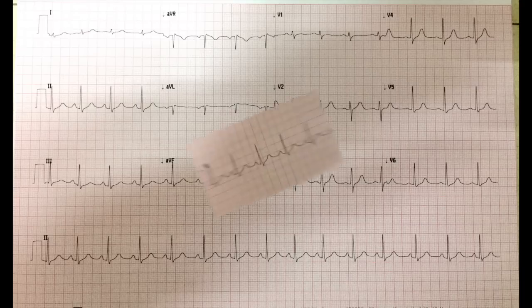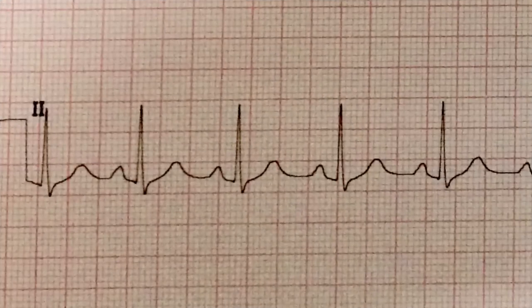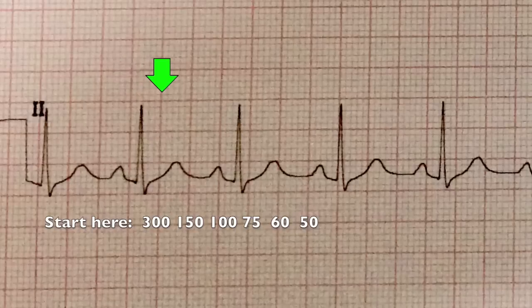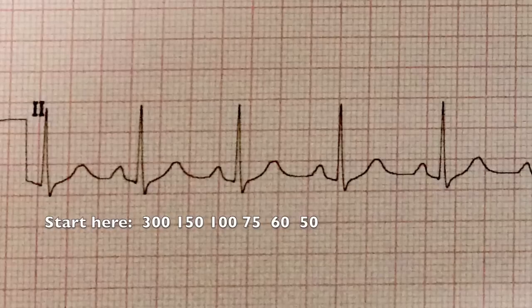Here is a normal EKG. I go to the bottom lead 2 to evaluate the rate and rhythm. If your EKG doesn't automatically display a heart rate, the 300 rule is a great tool. Every big box has a numerical value — if your QRSs are one big box apart the rate is 300, two big boxes apart the rate is 150, and so on. The rate for this EKG is just under 100, approximately 90 beats per minute.